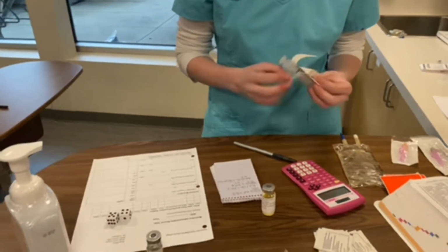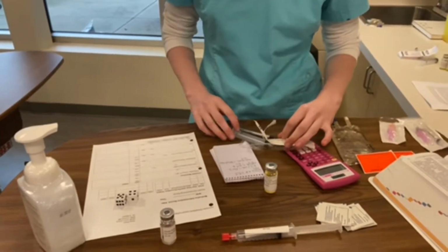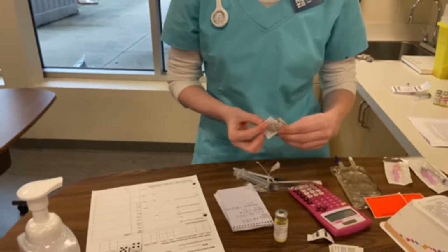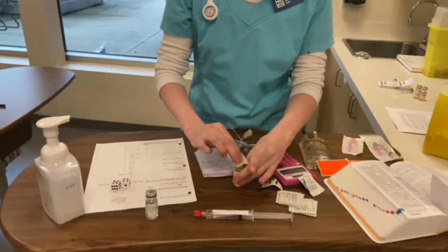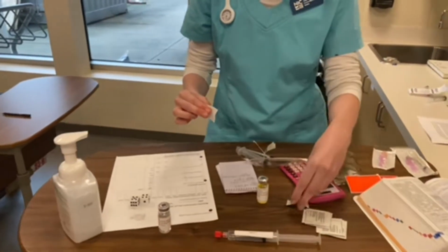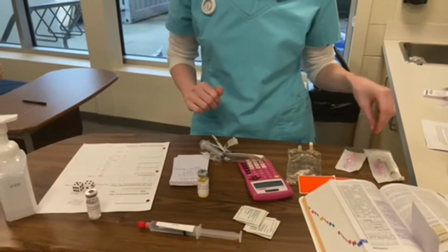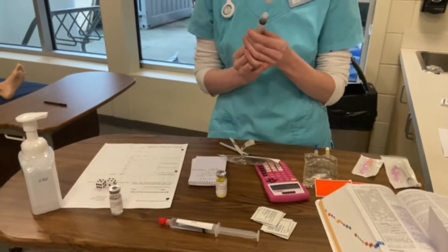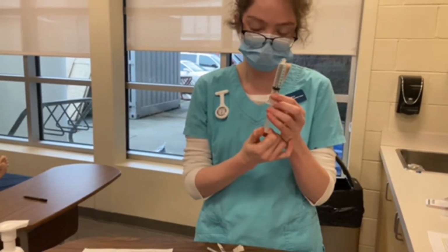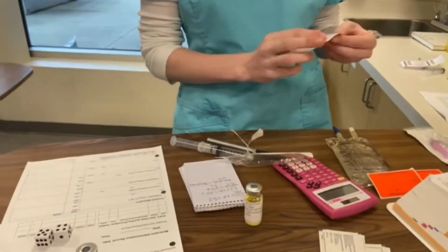milliliters of sterile water. I'm going to place this in the sterile field and sanitize the tops. And while that's drying, I'm going to do 8 ml of air and place the top in the sterile field to maintain its sterility.